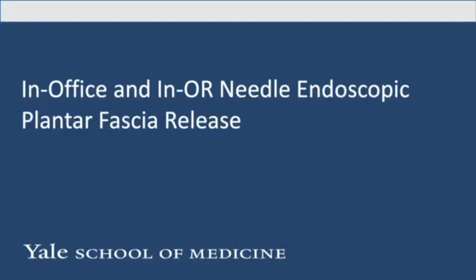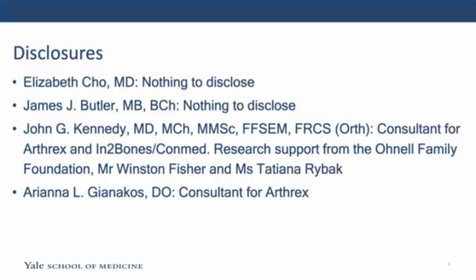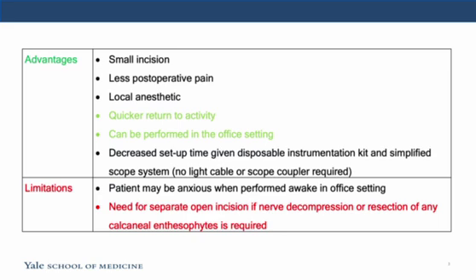The following is our technique guide for in-office and in-OR needle endoscopic plantar fascia release for chronic plantar fasciitis. Advantages of this technique include the utilization of only one portal with a smaller incision, which can result in reduced postoperative pain and a quicker return to activity.